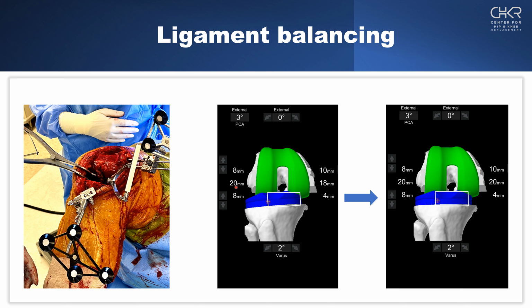So here I can see the back of the knee on the medial side is 18-20. So I still have a 2 millimeter asymmetry in my gap. So I have more than enough space now for an insert, but I have an asymmetry.